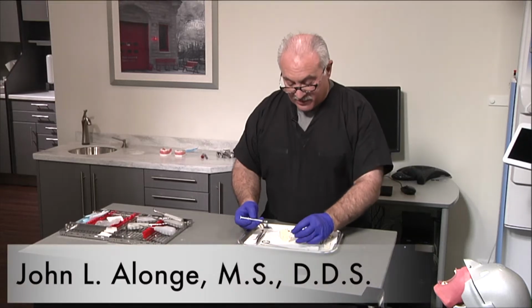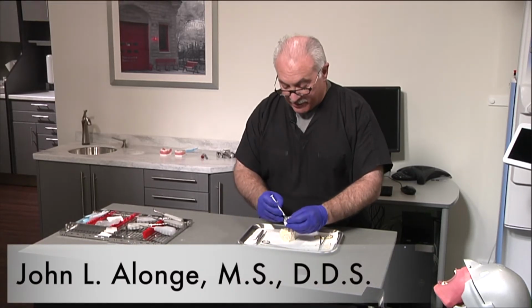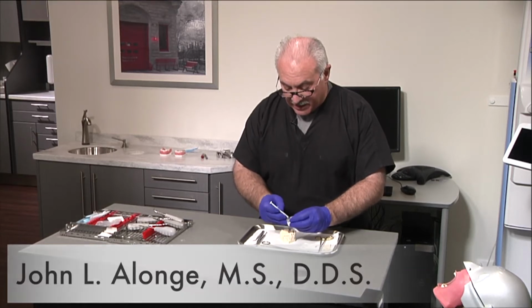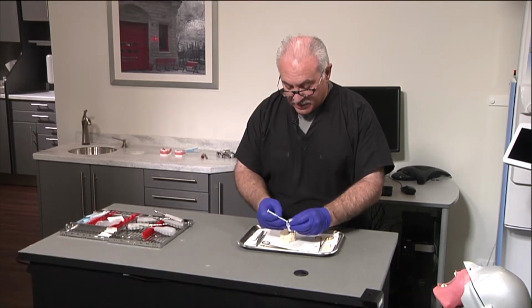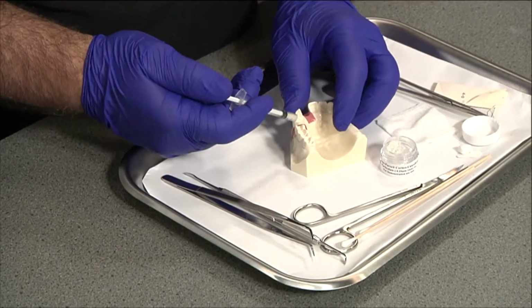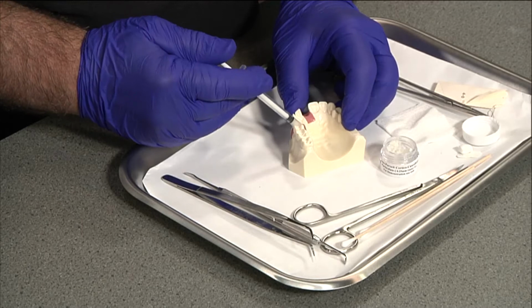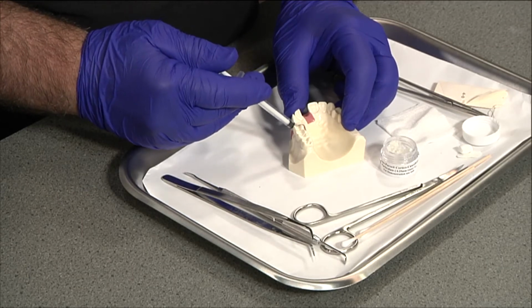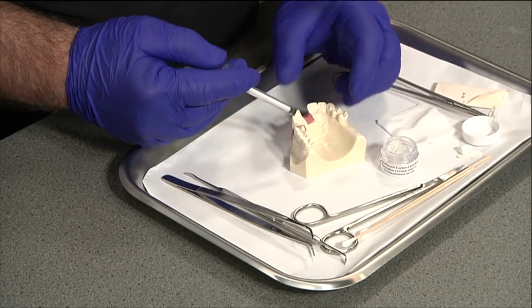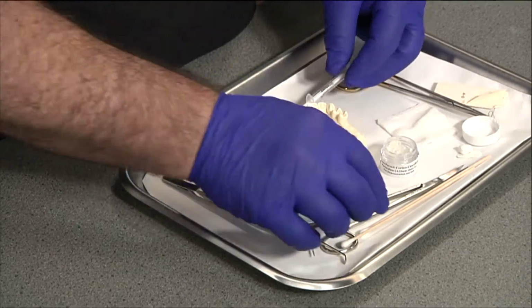So I've pre-mixed the simulated allograft bone, and I've drawn it back in the syringe. I have about 2/10 of a cc of bone. Then incrementally, in the premolar, place it. And you never exceed beyond the crestal bone.